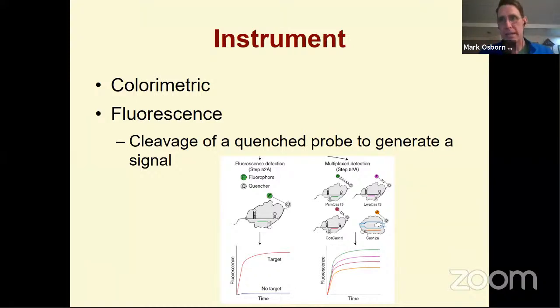And so that's the lateral flow assay component of it. Again, it's an analyte that requires FITC and biotin marking. Also, there are more infrastructure-intensive methodologies using either colorimetric or fluorescence detection. And while this requires more specialized instrumentation and maybe some more specialized operational training for a technician, it does allow for higher throughput and the potential for multiplexing. So using different fluorescent colors to detect multiple analytes simultaneously. And so I'll talk about how we employed those properties.